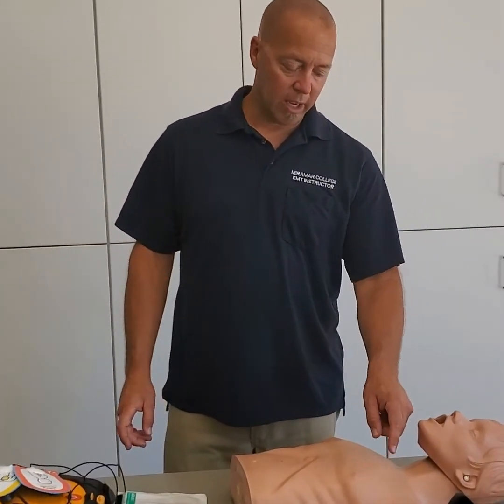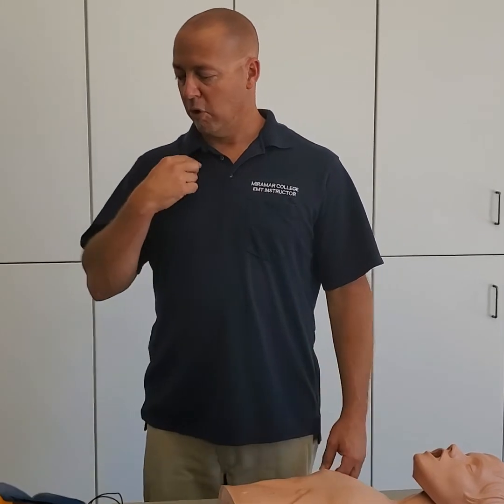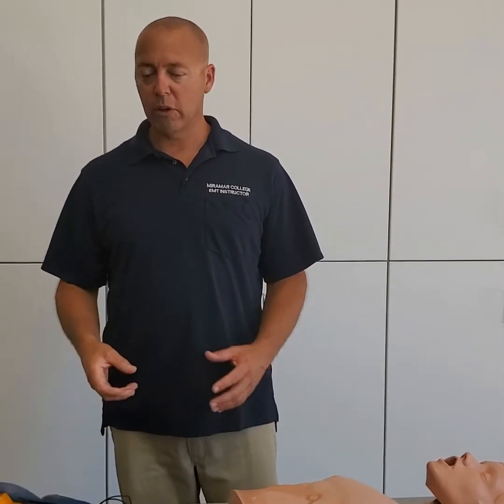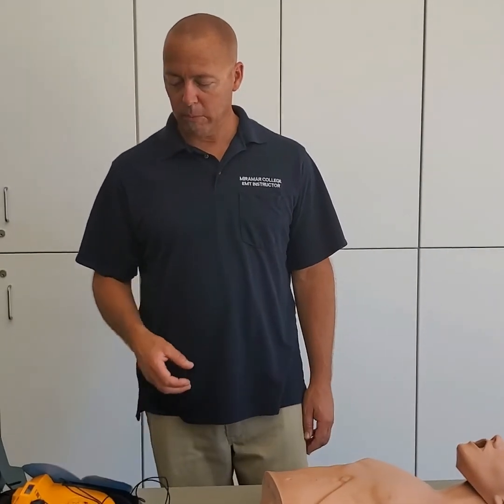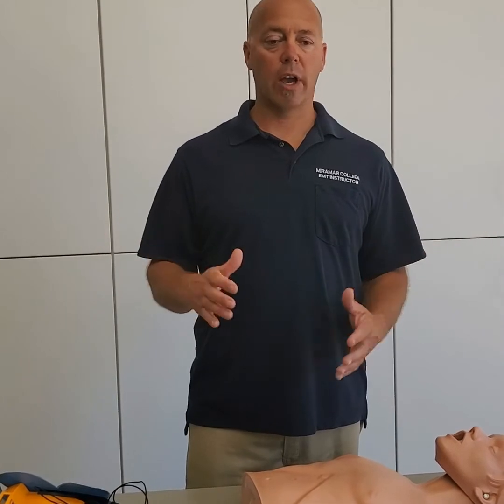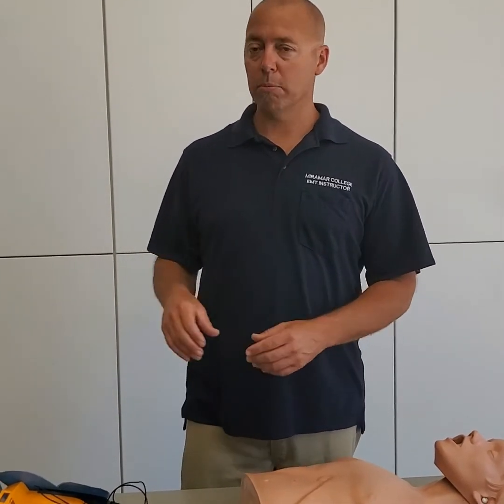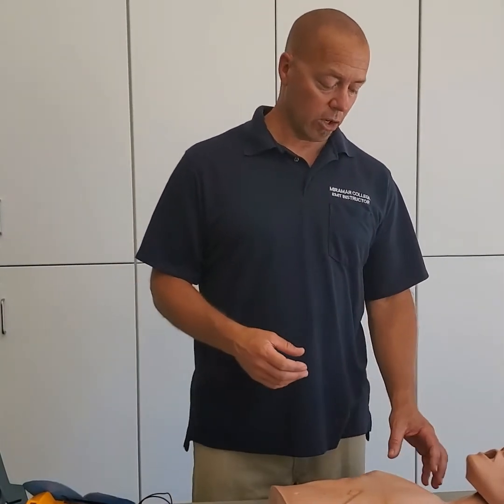A couple other things to consider. If they have any implantable devices, so pacemakers and defibrillators, which are a little bump underneath the skin, all you need to do is try not to put the pads over that device. If it can't be avoided, that's fine. Just go ahead and put it on, because we want to use this machine as soon as it becomes available, so we want to use it quickly.